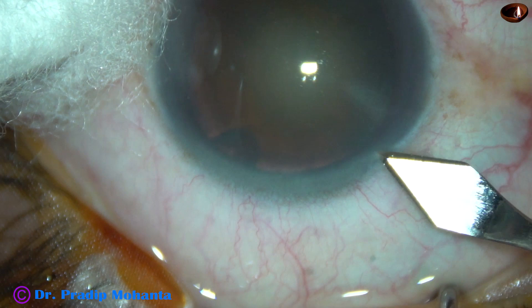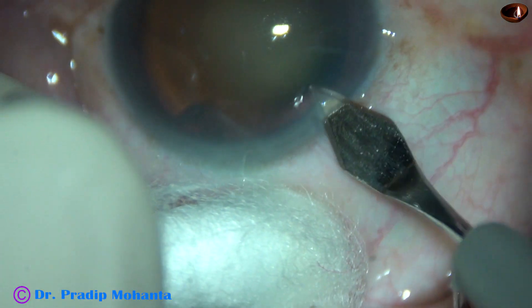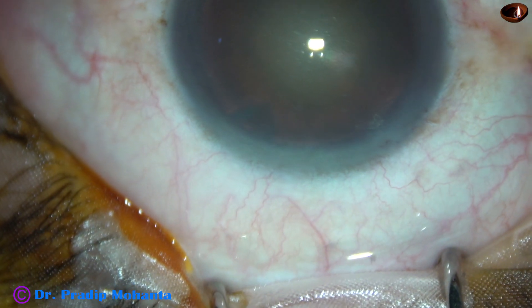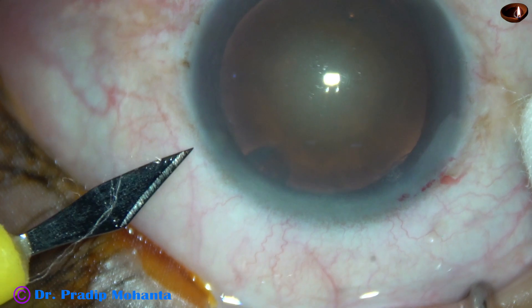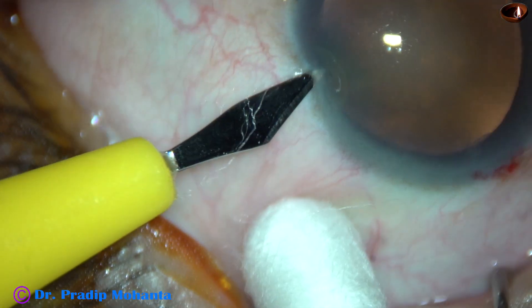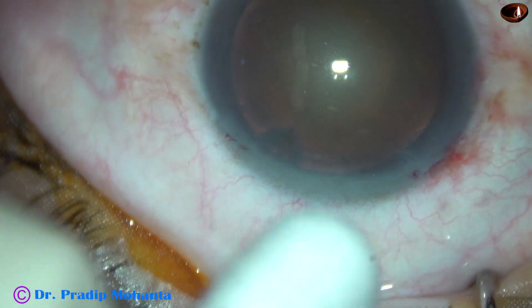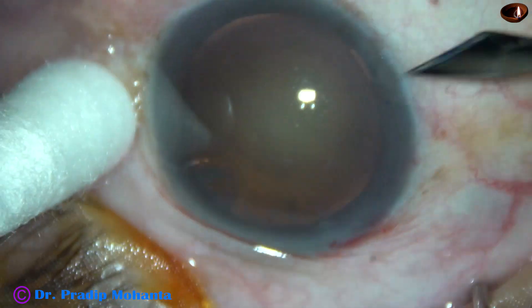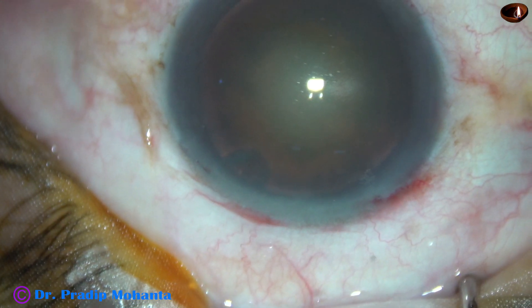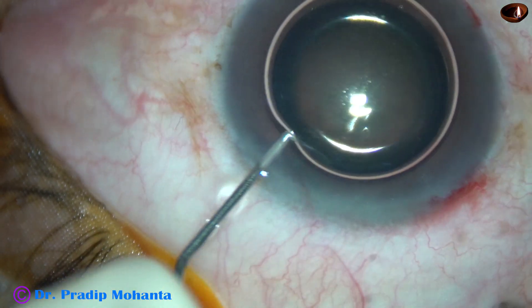This is the main incision with a 2.8 mm steel keratome at mid-limbus. There is little oozing of blood at the main incision. This is a side port on the left side of the main incision, with also some little ooze. And this is another side port on the right side of the main incision, also with some little oozing of blood vessels.